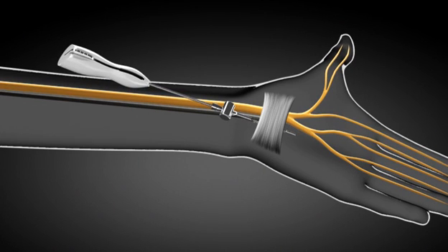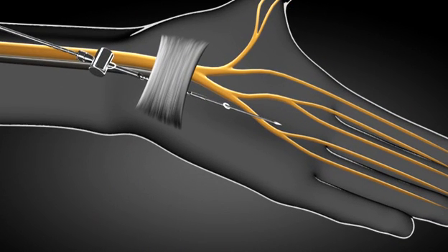Once the carpal tunnel release blade assembly tip is properly positioned at the palmar exit point, the carpal tunnel release blade is advanced by advancing the proximal thumb lever. Advancing the thumb lever exposes the carpal tunnel release blade cutting surface.